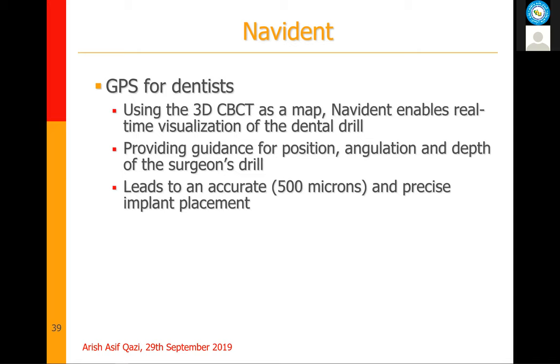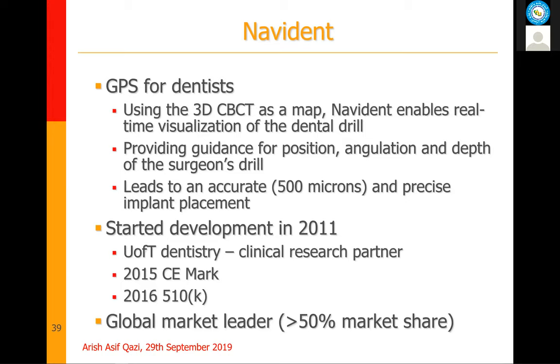We started development of the system in 2011 as a two-person team. The system was co-developed with our clinical partner, which is the UFT dentistry school. Since it's a medical device, you cannot just develop it and start selling it. You have to do clinical trials and get regulatory approvals. The device was approved for sale in Europe in 2015, and then it was approved by the FDA in 2016 for sale in the US.